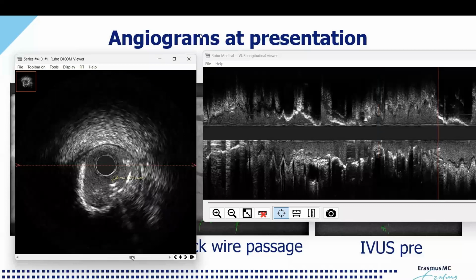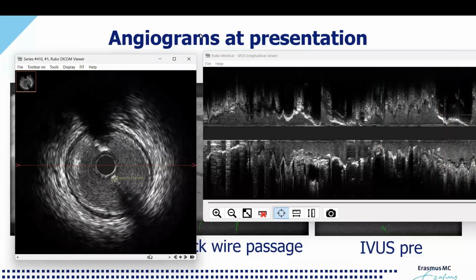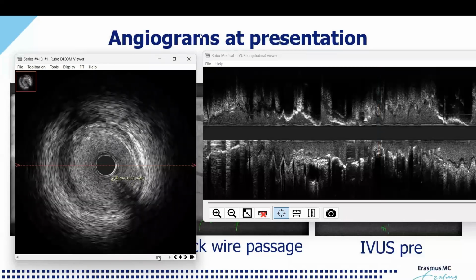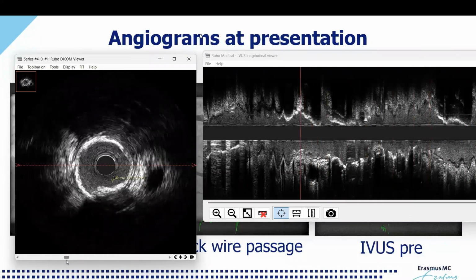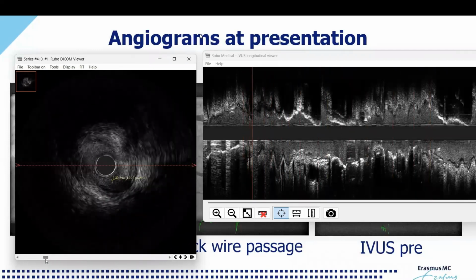And here's some malposition, but that's not very impressive in there. And here we have the proximal right coronary artery. Was there also a stent distally, or was there just a stent proximally? It was just a stent proximally. This was only calcium. This was the calcium, and I think that here we have the migration distal of the thrombus.